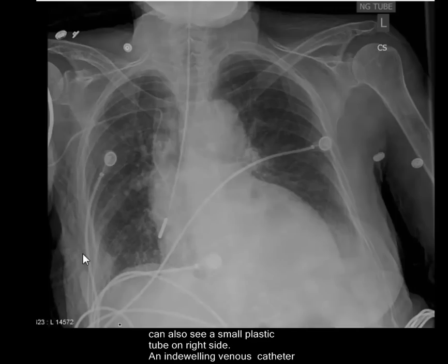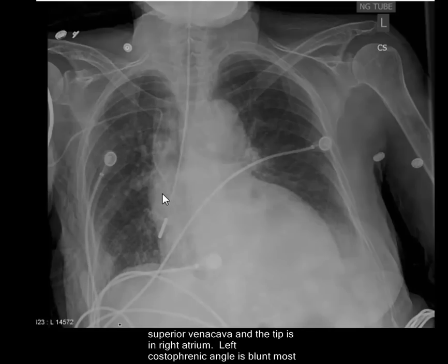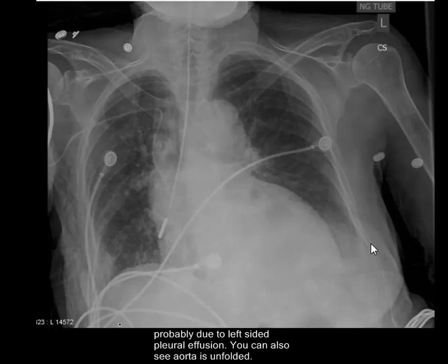An indwelling venous catheter, a venous access line, is present. It is inserted from the right subclavian vein, goes through the superior vena cava, and the tip is in the right atrium or just above the right atrium. The left costophrenic angle is blunt, most probably due to the presence of pleural effusion. You can also see the aorta is unfolded.